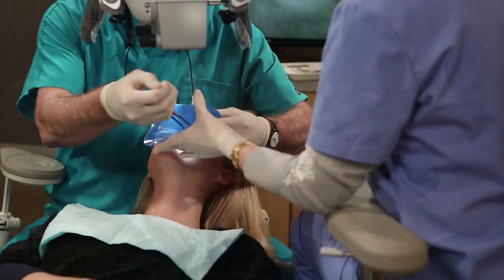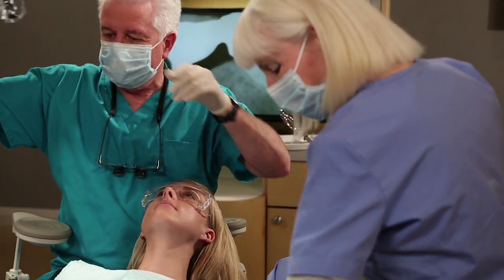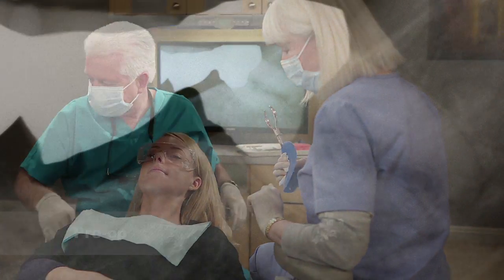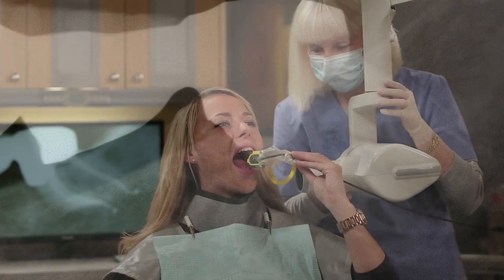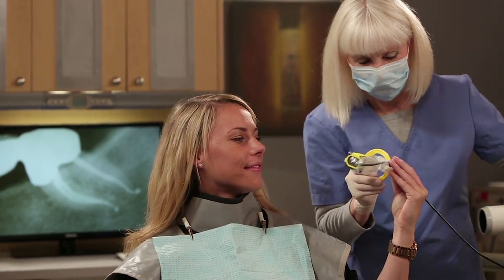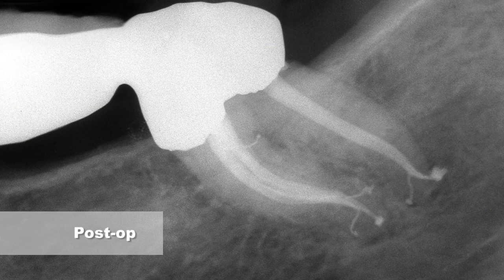I hope you've enjoyed watching this endodontic procedure. We've covered the steps that comprise start-to-finish endodontics, focusing on shaping canals. To appreciate the postoperative result, let's review the preoperative film. Again, notice the bridge and the orientation of the underlying roots. Appreciate the canals are long, narrow, and highly curved. When we look at the post-op film, it reminds me of the old expression, the thrill of the fill. Notice in this particular instance, we've re-provisionalized the bridge, we have smooth flowing shapes, and we've filled multiple lateral portals of exit.